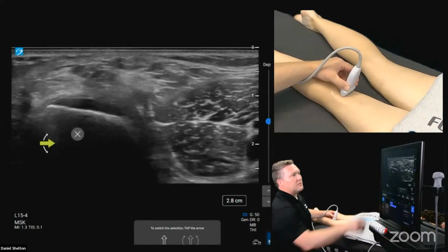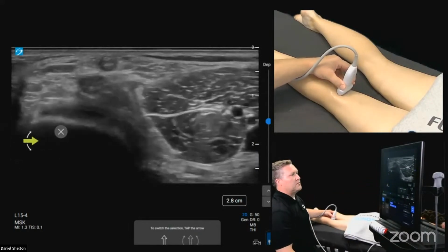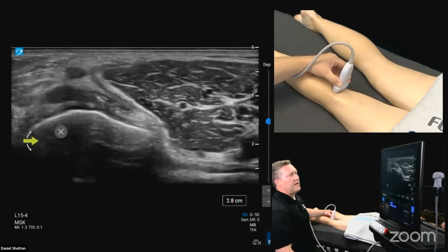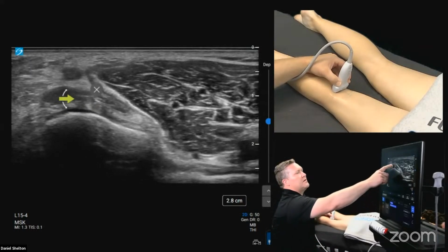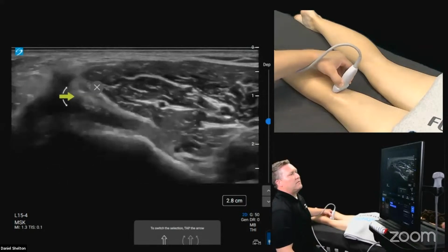But now I'm going to go distal, and I want to see the next skeletal reference point, which should be tibia. So I should fall into the joint and see nothing, and fall on top of the tibia, which doesn't have that articular hyaline cartilage cap. So we're on the tibial portion, and I can tell that there's a tendon here because it's anisotropic, and we're going to use angle artifact to our advantage.